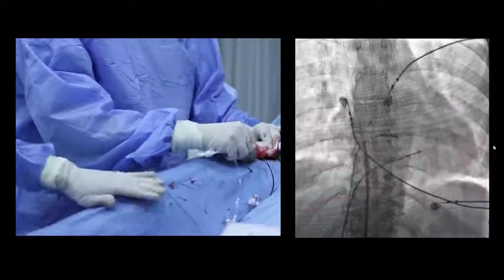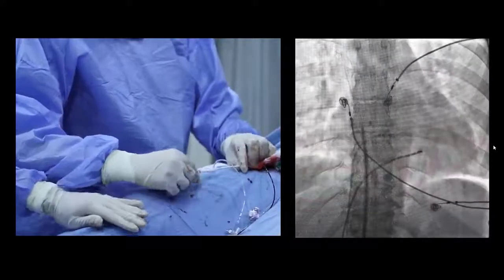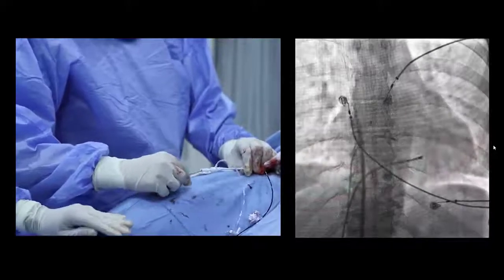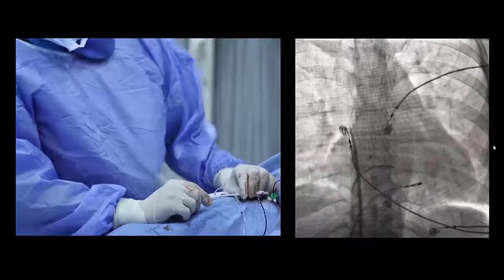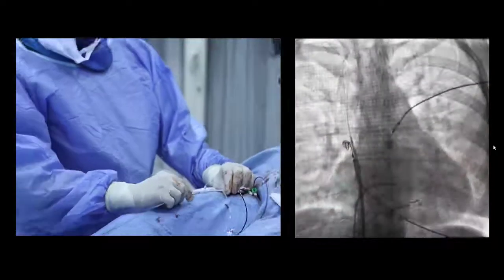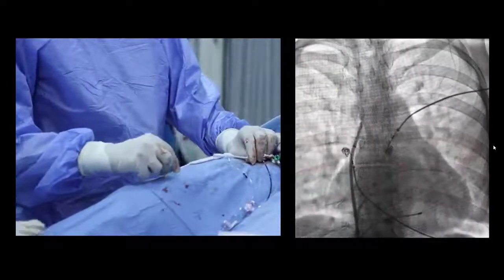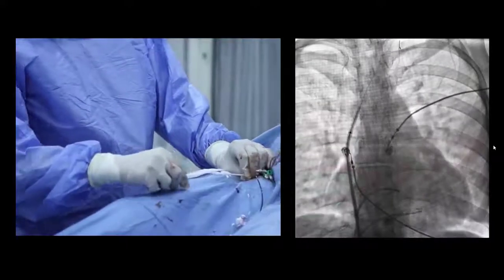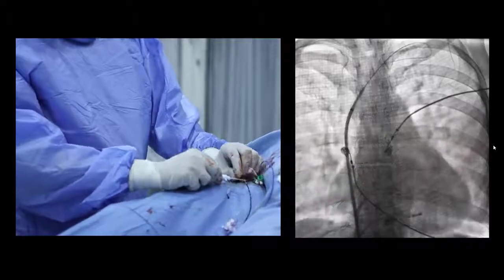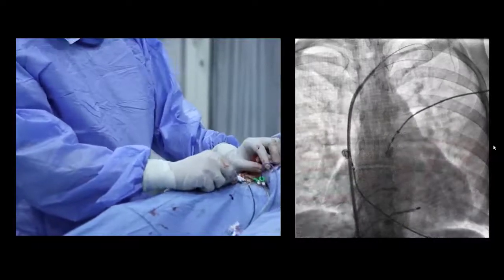Then, guided by the wire, we inserted the long sheath. Here we try to navigate the wire to be in the left subclavian vein, with some trials to get the wire from the right subclavian vein into the left subclavian vein. As we can see, we are pushing the long sheath.